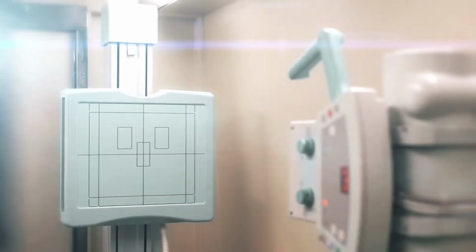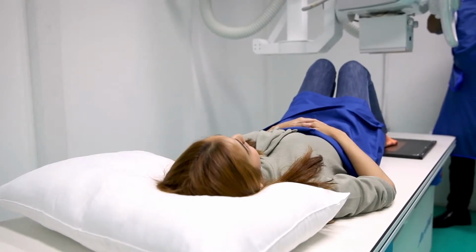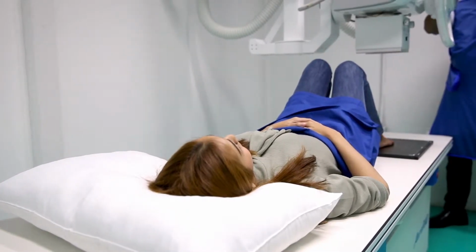Well, RadNet has a number of musculoskeletal imaging modalities that we use. The most common one are regular x-rays, and they tell us a lot of information about cortical bone and general information about joint spaces. They're easy to do, they're fast, and they're relatively inexpensive.